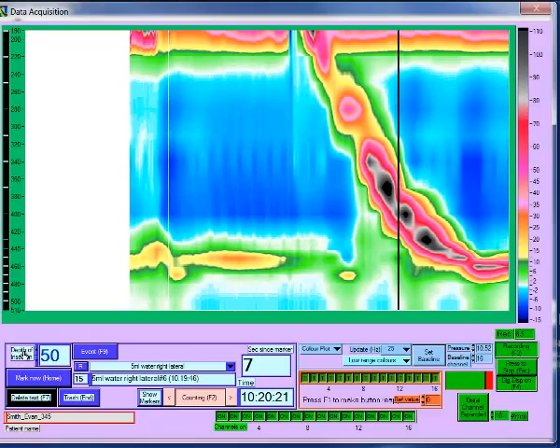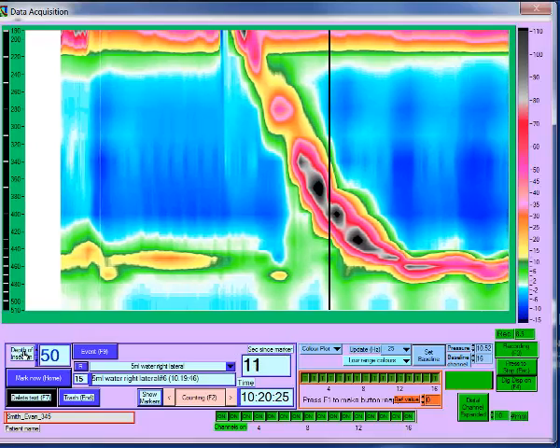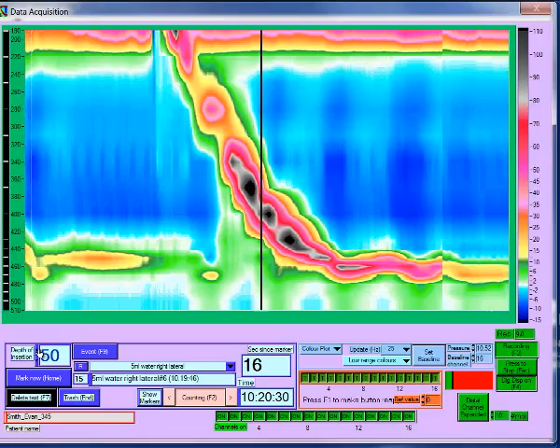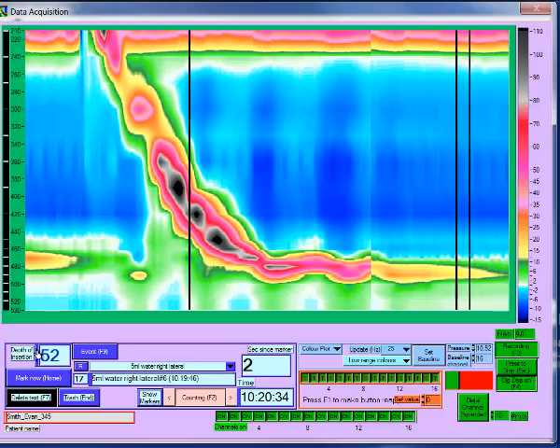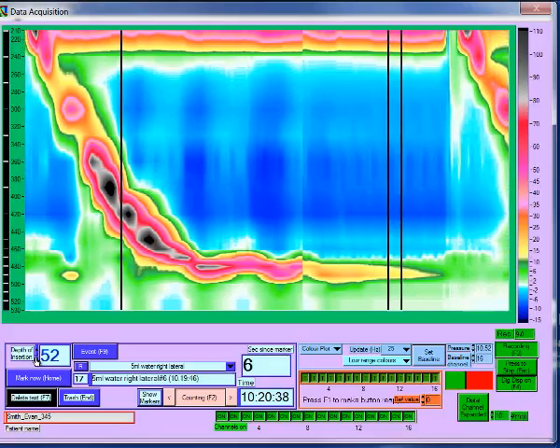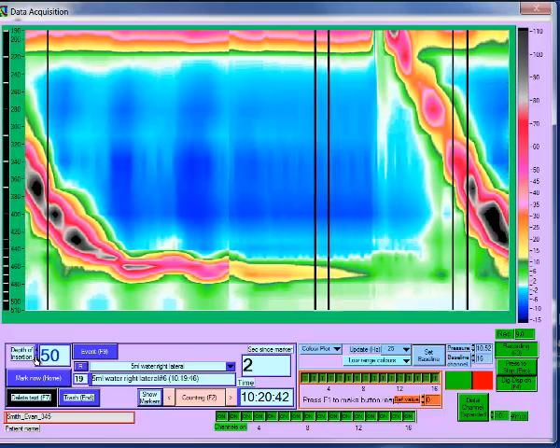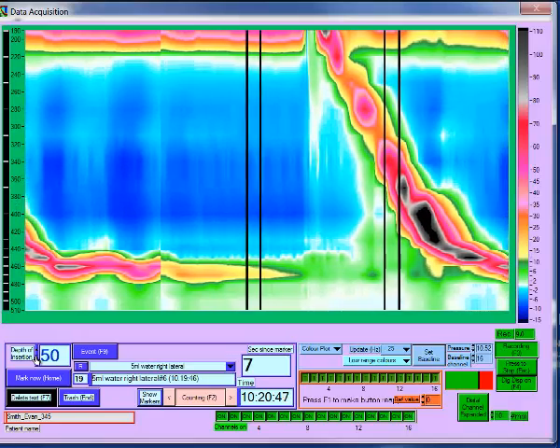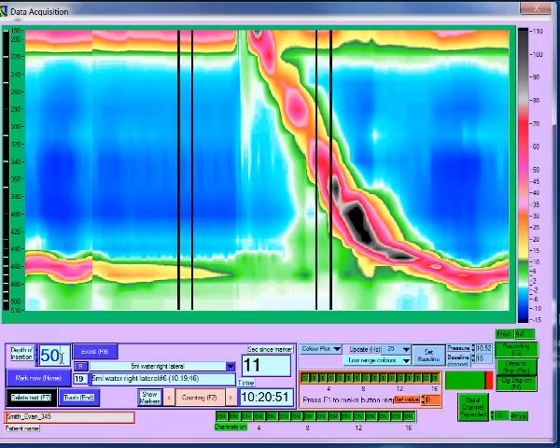The depth of insertion control should be adjusted so that the number corresponds to the depth of insertion of the manometric catheter at the nostril. Changing this will automatically enter a marker. You can either type in the new number or use the arrows at the side to increment and decrement the number. Each time the depth changes, a new marker is entered, so if you have to change it by a significant amount, it's more efficient to type in the new number.